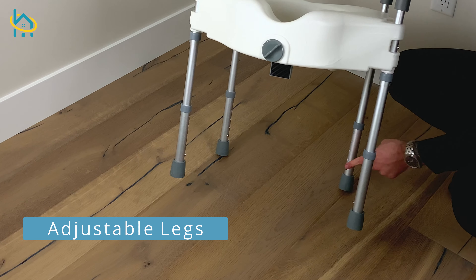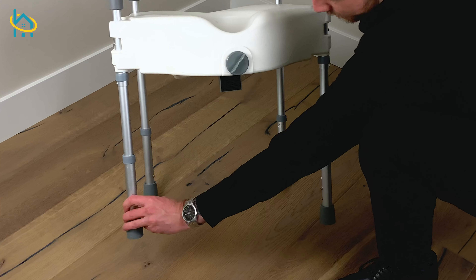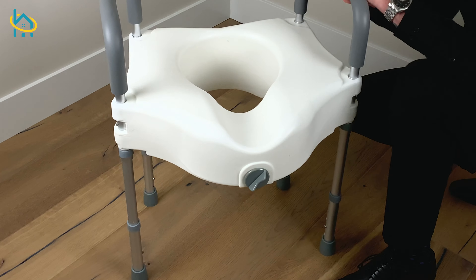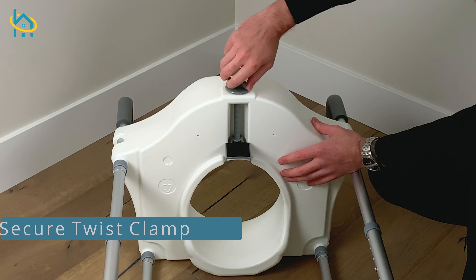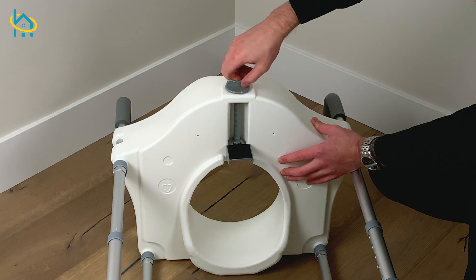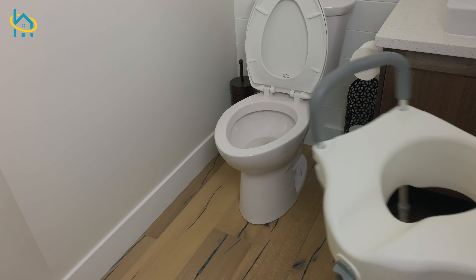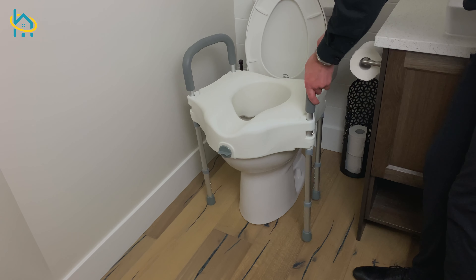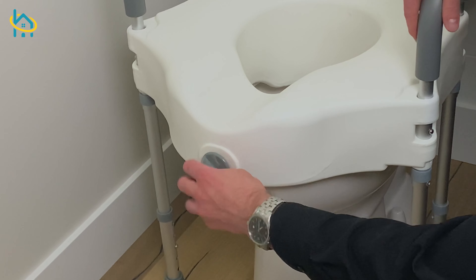Now you can change the height of the seat by adjusting the length of the legs. This seat also comes with an easy twist knob to secure the seat to the toilet bowl. Installing your MOB raised toilet seat with legs is as easy as placing it over your toilet, making sure the legs are adjusted to the correct height, and tightening the knob to secure to the bowl.